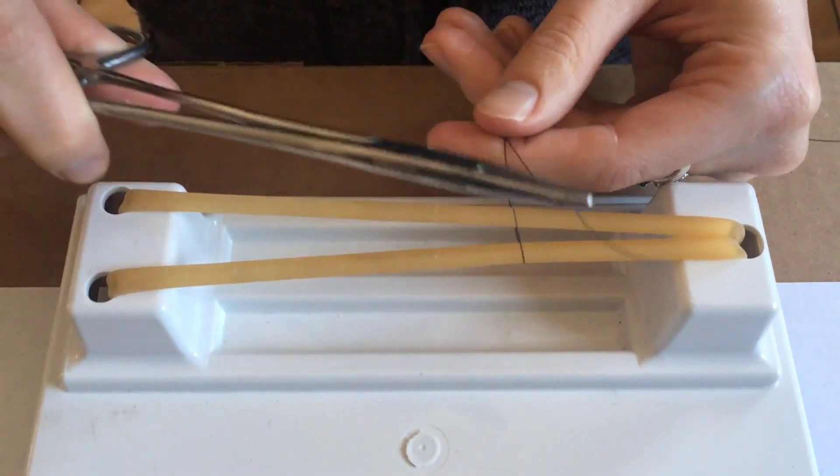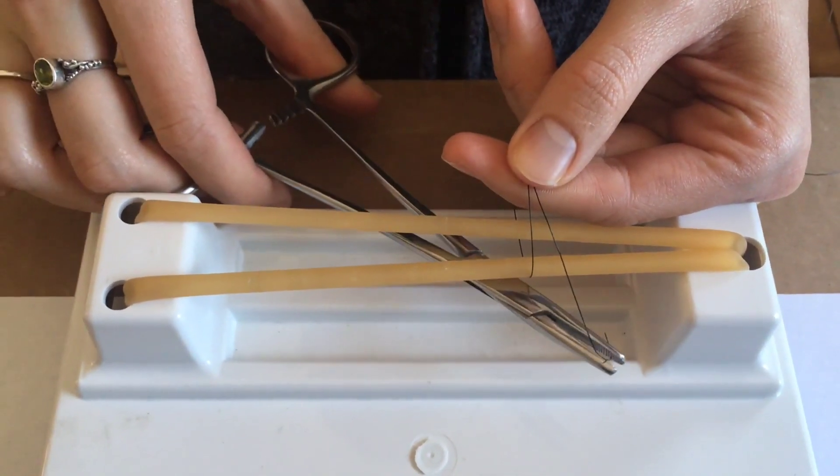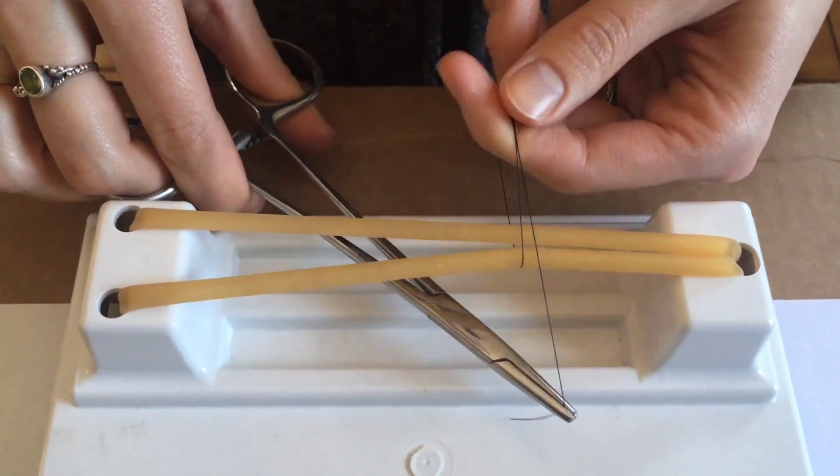Wrap it around your finger like this. Once again, put your needle drivers underneath and pull it around.